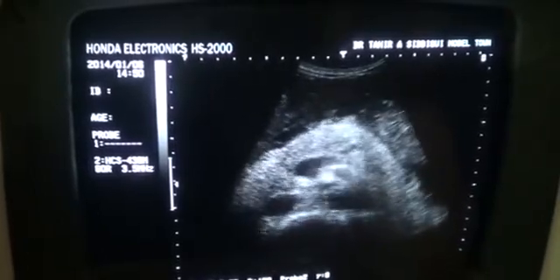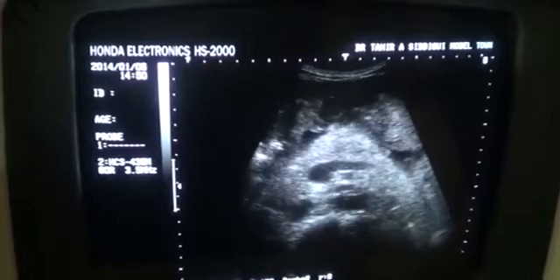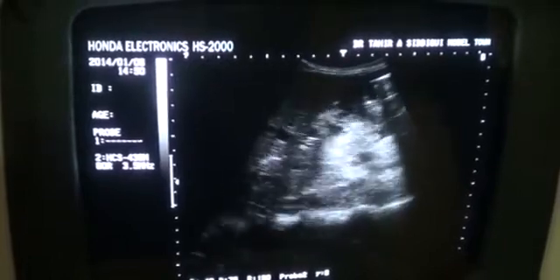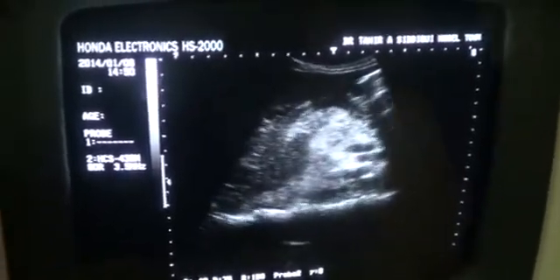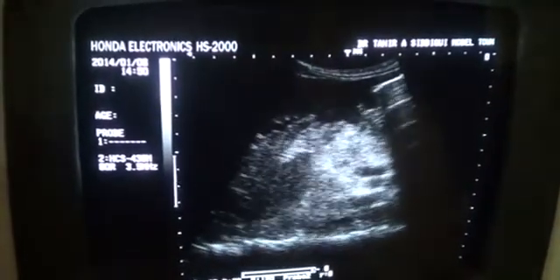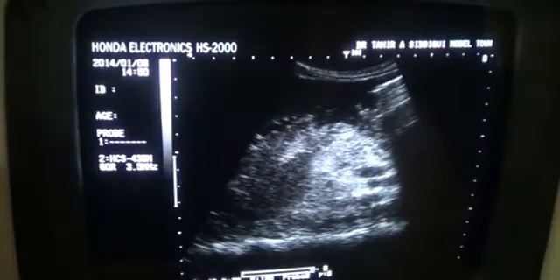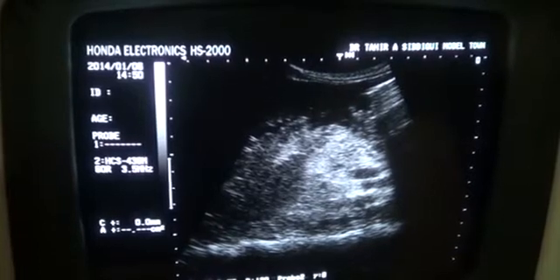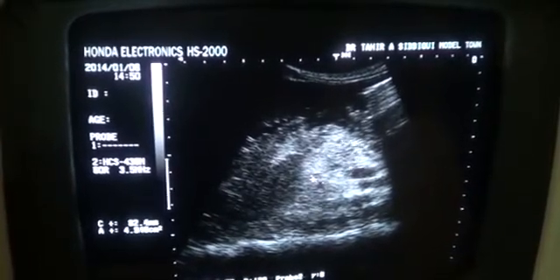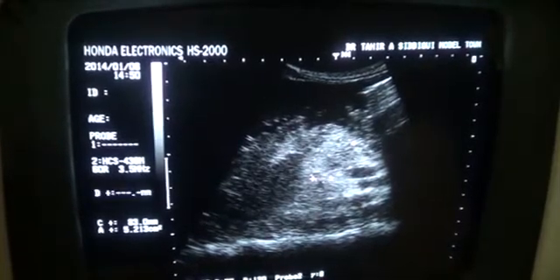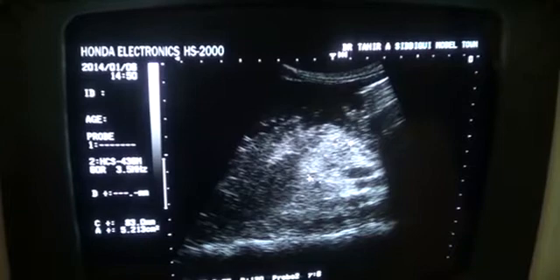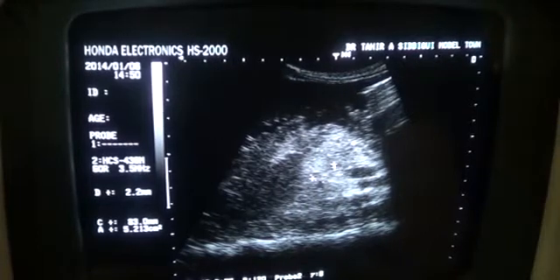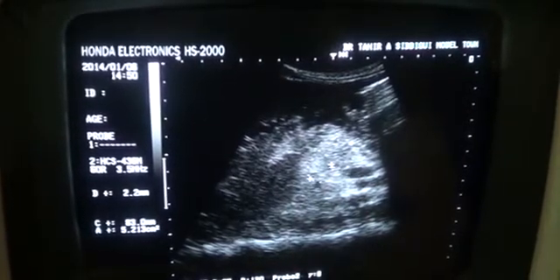In dimension and echogenicity, keeping in view the age of the patient, this is the longitudinal section of the head of the pancreas. The central dot seen is the pancreatic duct. This is the head of the pancreas. There is a tiny cystic area — approximately 2.2 millimeters — at the region of the head.